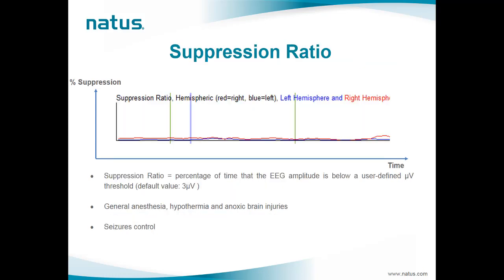The suppression ratio trend displays a running average of the percentage of EEG activity that falls below a user-specified amplitude threshold as a function of time, with time on the x-axis and the suppression ratio measure as a percentage on the y-axis. The blue line represents the suppression ratio in the left hemisphere and the red line shows the suppression ratio in the right hemisphere.